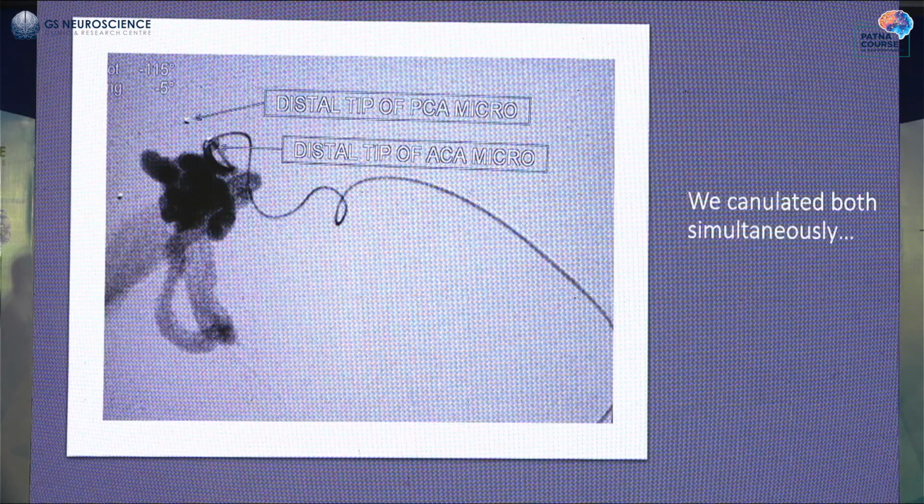Though it looks like a homogeneous tuft of tissue, once you do these microcatheterizations you understand that they are actually different compartments, and the whole philosophy of your injection becomes different. You cannot think of penetrating from one to the other.